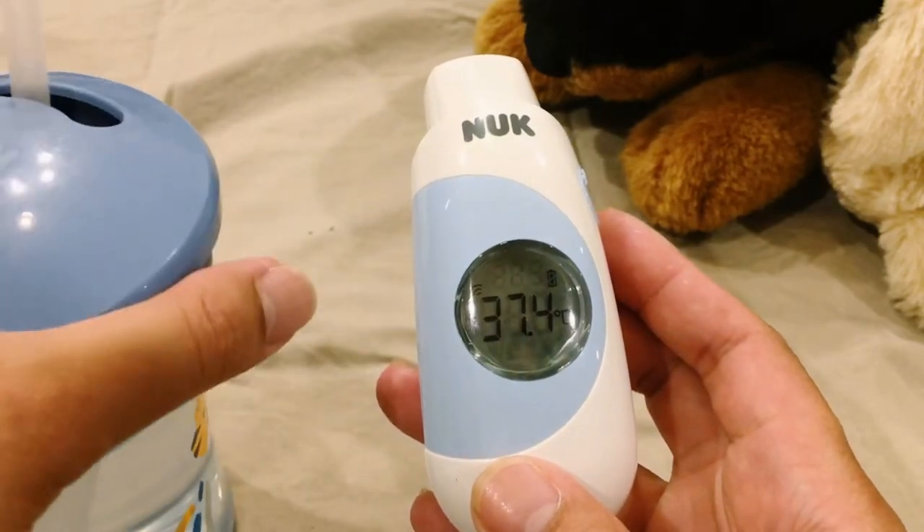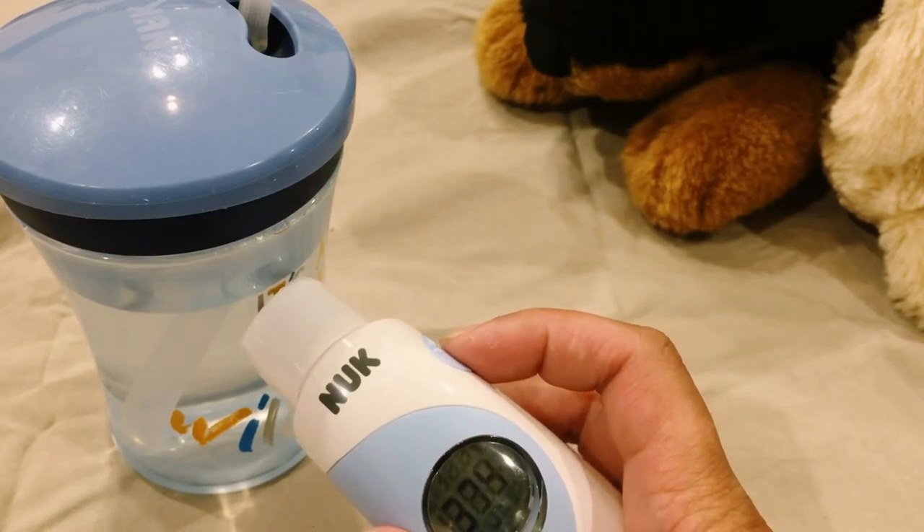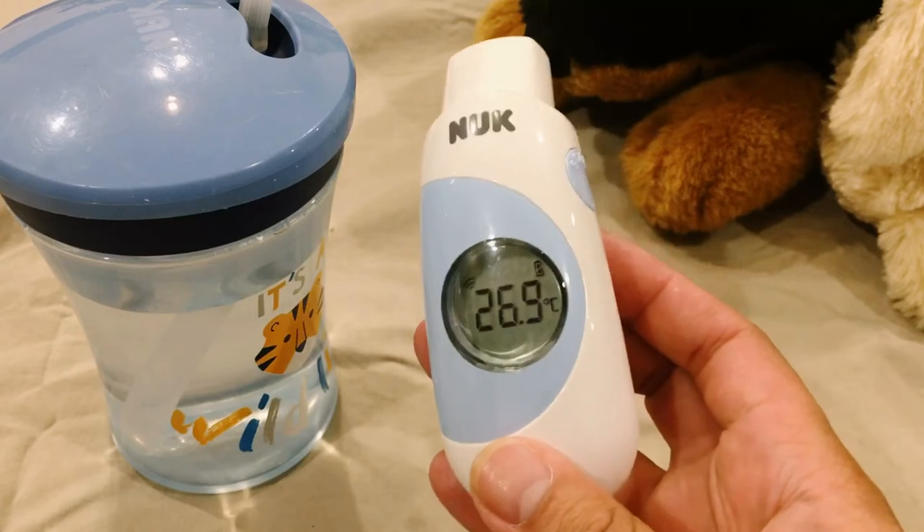Now we are going to switch to the water bottle and scan the water. The water in this bottle is 26.9 degrees Celsius.